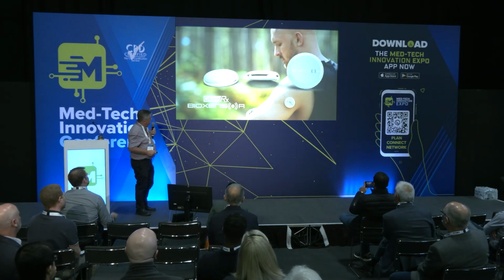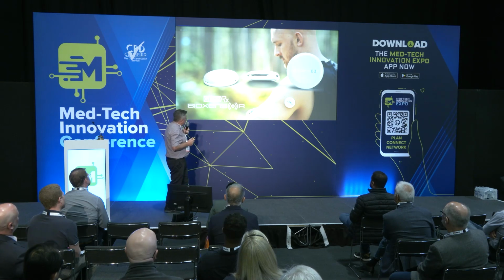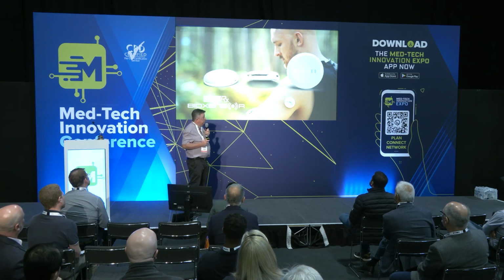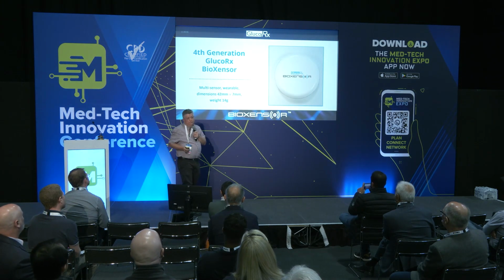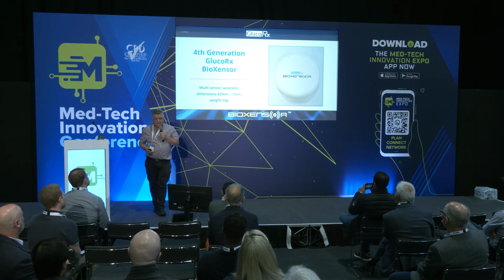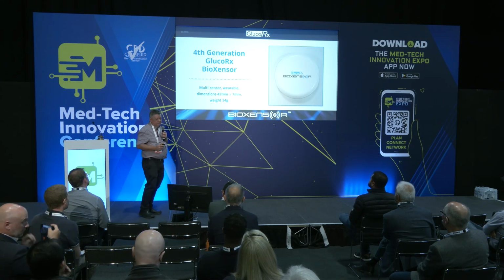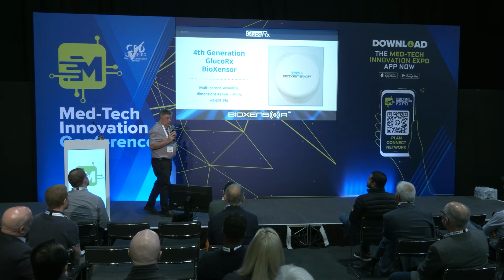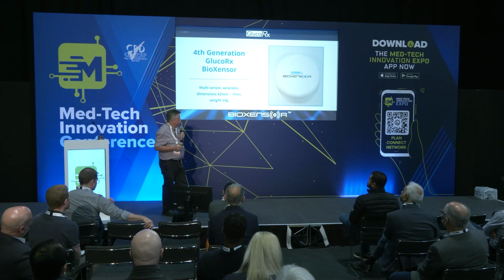So this is where we're trying to head, anyway, with Nilesh on board, is towards the 4th generation sensor, which is our Bioxensor. But in there, we have to have other types of sensing technologies. Ideally, other parts of the electromagnetic spectrum, because the RF is going to give us really good information, but it's probably not going to be good enough on its own.